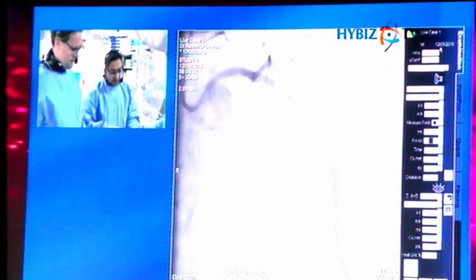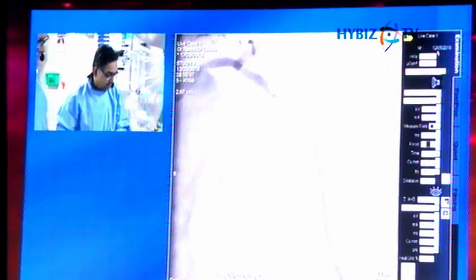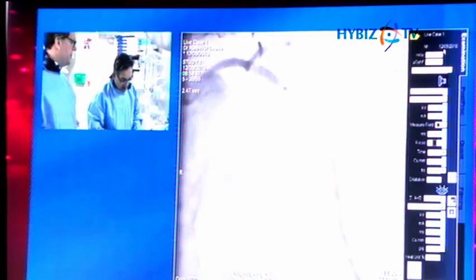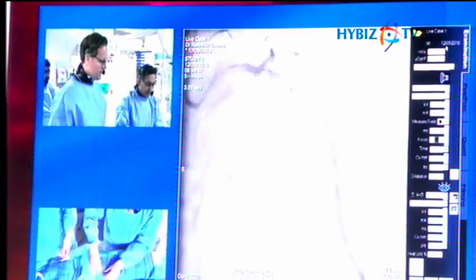That's a fascinating case. Was your choice of the Stentys device, is it approved in the UK, or is this part of a study? You picked it based upon this aneurysmal area approximately, or tell us a little bit about your logic behind the choice? Exactly. I mean, it's fully CE marked in the UK, and it's in quite extensive use in European centres.